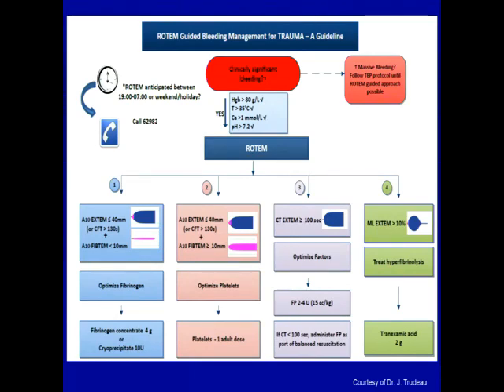Cardiac surgery, well, based on what we just talked about, takes a good 10 minutes. The A5 is not validated yet. The 10-minute amplitude is the only one that's validated against the overall final amplitude. So by the time you draw the sample, run the sample, and get to 10 minutes or close to it, you're looking at 15 minutes overall, maybe 20, depending on where the sample is and where you're running the test, in the lab or up in the OR.